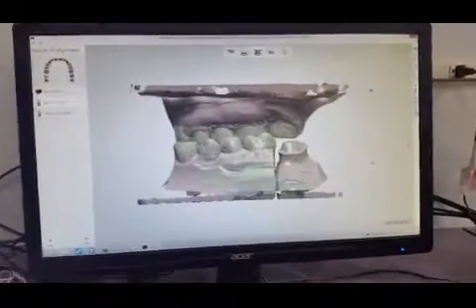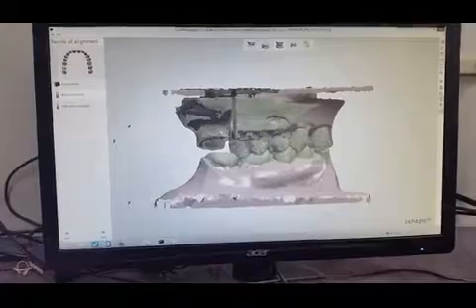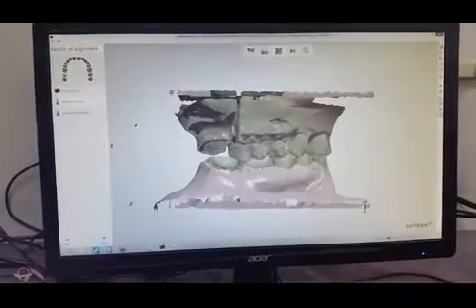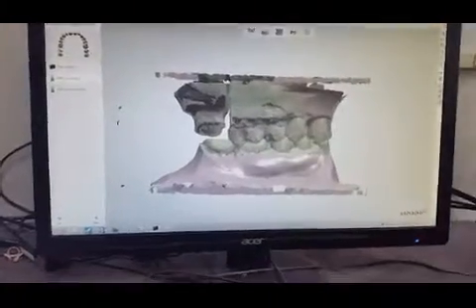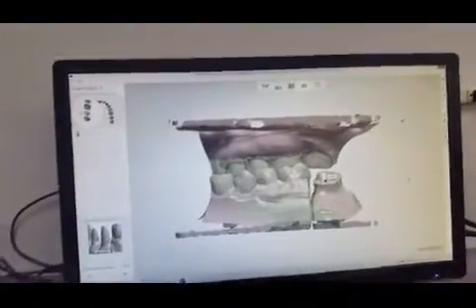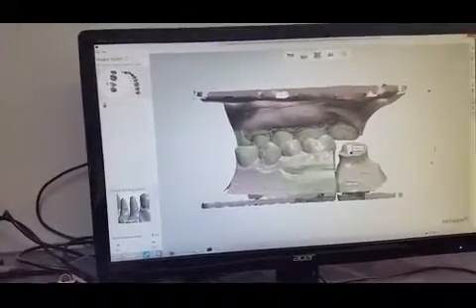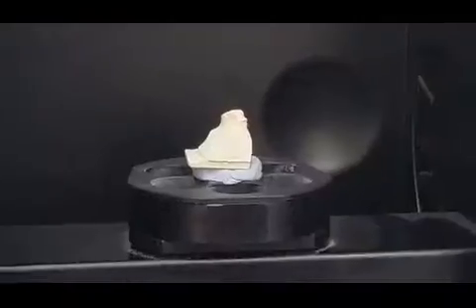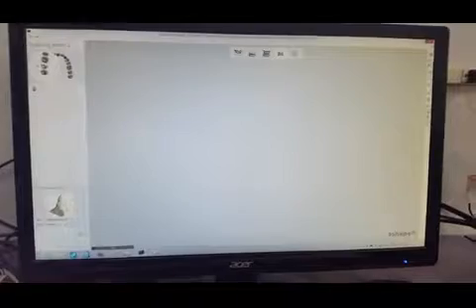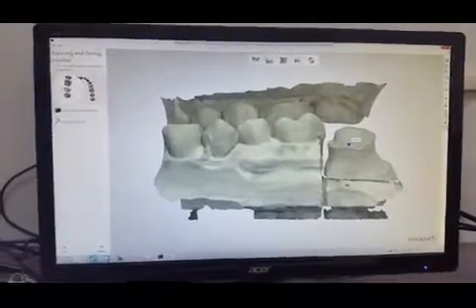And here it is. It's asking me at this point if this looks alright, or wants me to verify that this is the bite. Which it is. So this looks good. We're going to tell it to go ahead and proceed. Now it's asking me to put the tooth or just the die by itself, to scan that so it can get a clear margin all the way around. And here's the die. We'll close that. And there, it's finished.